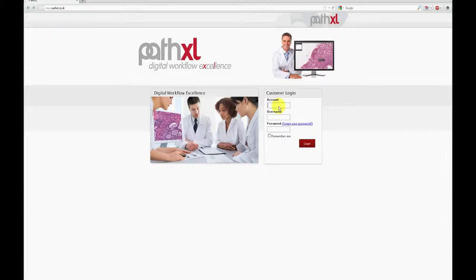Users access the system using secure login details. There are a number of types of users with different levels of permission. As the course tutor, your login will give you permission to create, modify, and control course content. As a student or resident, you will have permission only to view the course, materials, and tests that have been developed by the course tutor.